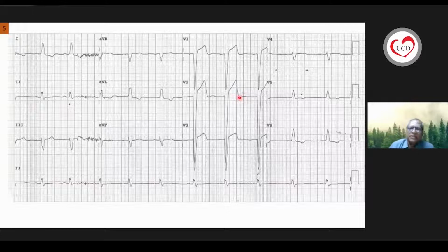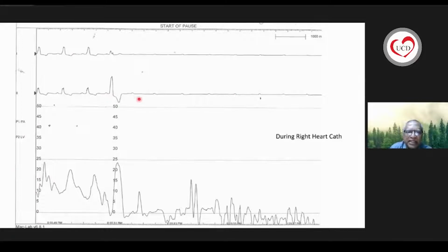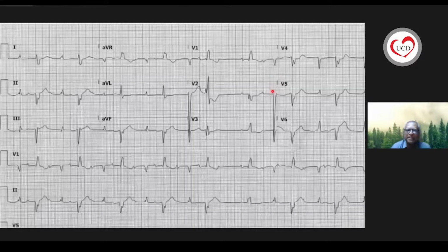And again, when you have these patients with bundle branch block, you need to be extremely careful when you take them for even minor central vein insertion or pulmonary catheter insertion, because transient trauma to the existing right bundle can result. This is during a right heart cath in a person with a bundle branch block. The catheter-induced complete heart block can occur. You should be aware of this complication.